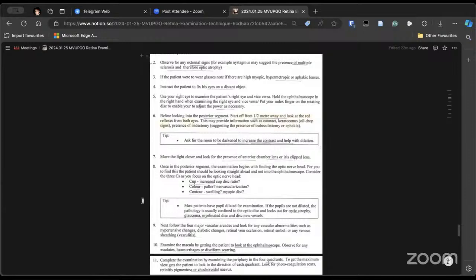So we look at, sir, may I? Yes, yes, Dr. Nana, please. The optic nerve head, we look at the size, the shape, the margins, whether well defined or not. Then the cup disc ratio, the vessels emerging from the disc, and if there is hyperemia or pallor of the disc. Okay, and also the neuroretinal rim. You have to tell the regularity of the neuroretinal rim, and if the ISNT rule is followed.